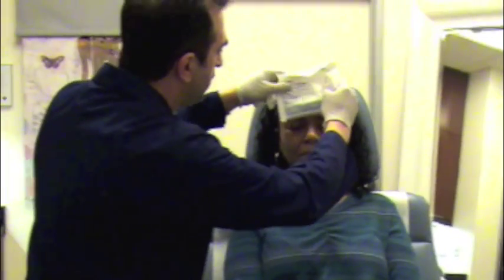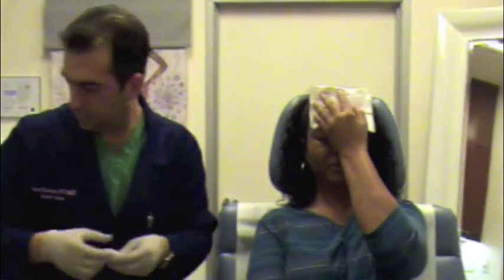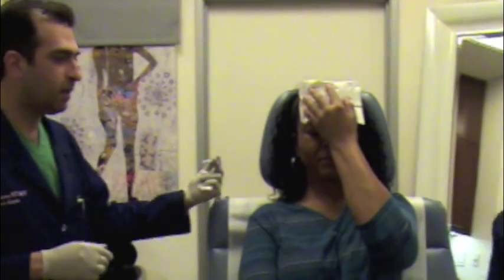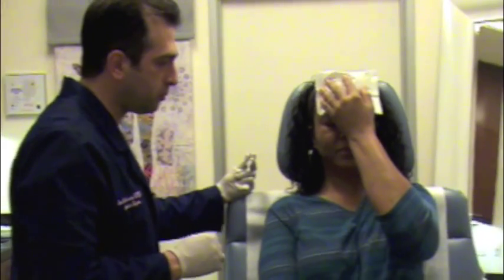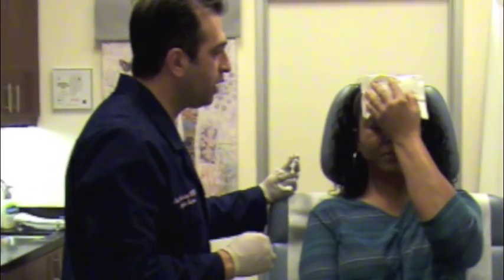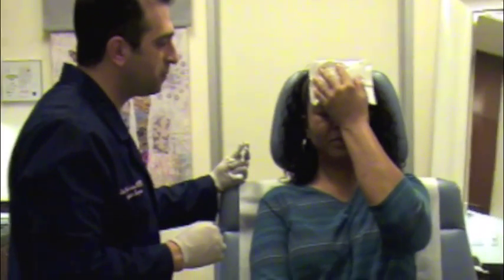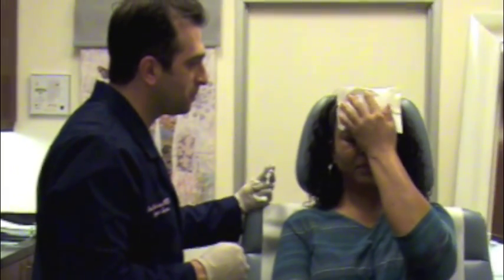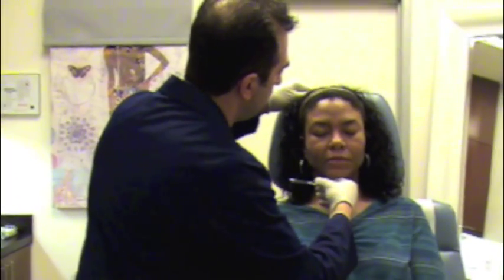This is a cold compress. If you'd be kind enough to just hold this for me. Thank you so much. You're going to feel about 3 to 4 pinches in that area. When you feel the area being cool, you let me know. That feels pretty good. You ready? Mm-hmm. I'm going to bring you.